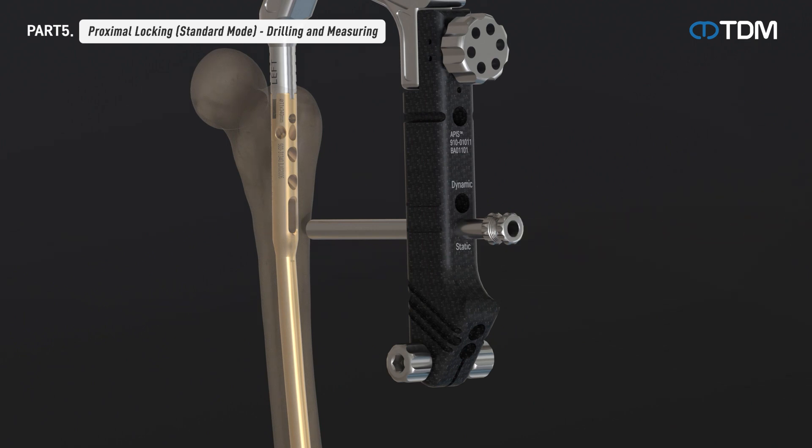After removing the drill sleeve, measure the depth with a depth gauge to determine the length of the screw, then insert the screw using a screwdriver. The remaining screws can be inserted in the same way.